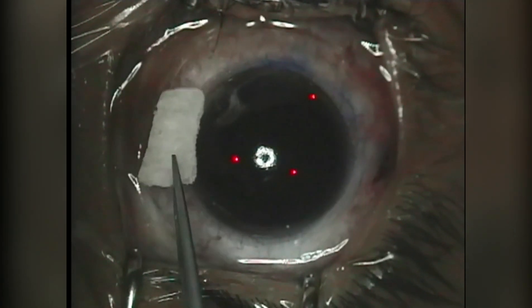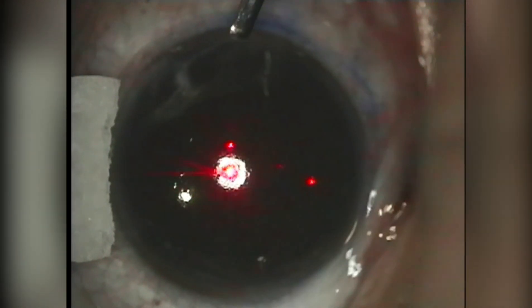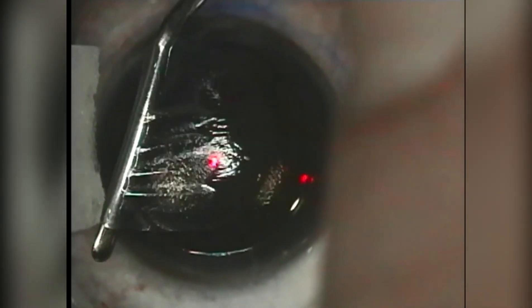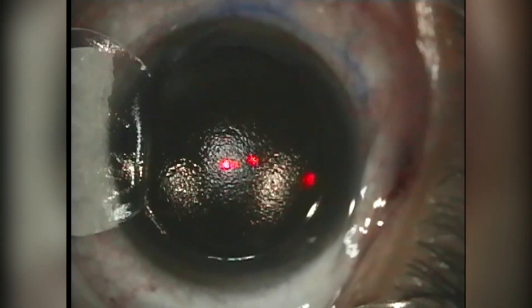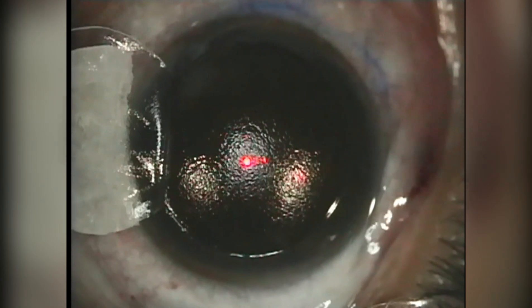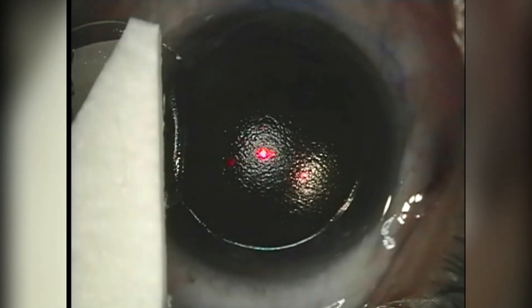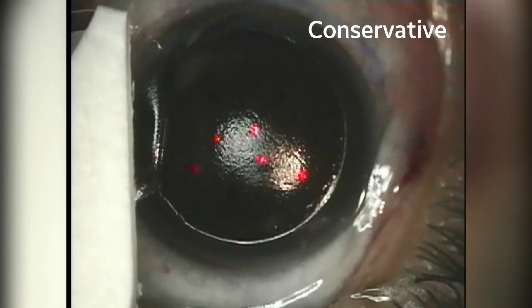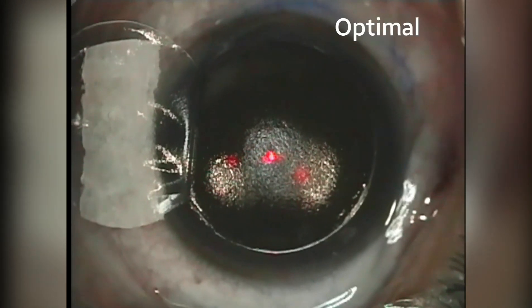The doctor prepares a pillow for the flap to rest on. He will then lift the flap from the bed and fold it back on its hinge. The corneal bed is now ready to receive laser shots. Laser is then fired in strategic points in the corneal bed to remove corneal tissue in order to reshape it. The amount of tissue removed is minuscule — one pulse of the laser removes a quarter of a hundredth of the width of a human hair. This amount was pre-calculated using a special machine that approximates the resulting grade that will best improve the patient's vision.